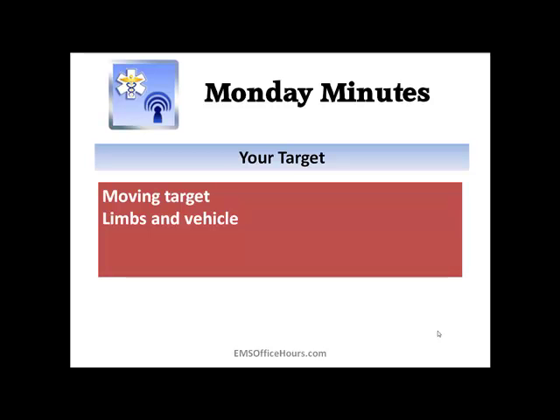One thing you can try to do is to lock the patient's arm in an extension and try to block that flexion at the elbow. So it might be necessary for you to sort of tuck the distal part of the patient's arm under your own arm, right? And be able to control that limb motion. And it could be the motion from the ambulance or the patient, either way. But try to maintain that contact, okay, of your hand on the patient's limb, okay?